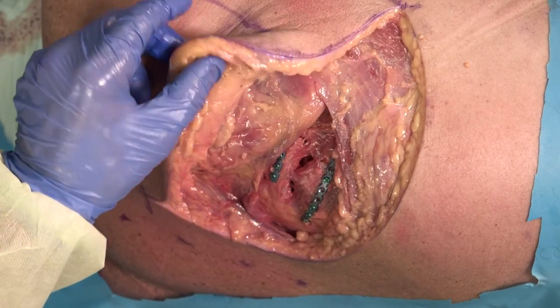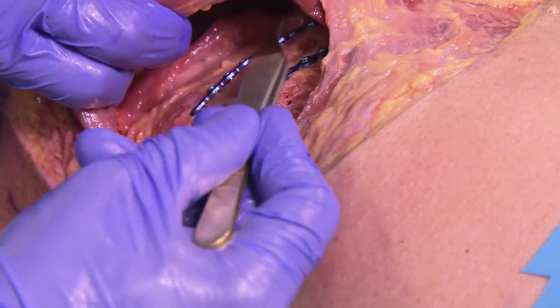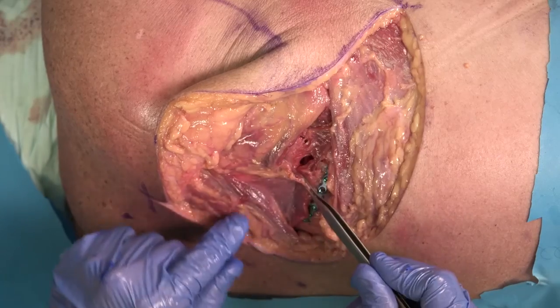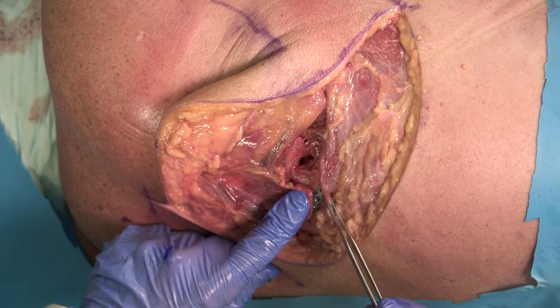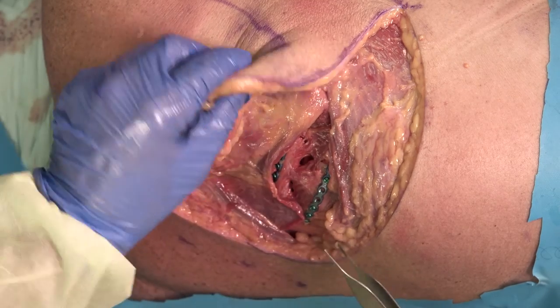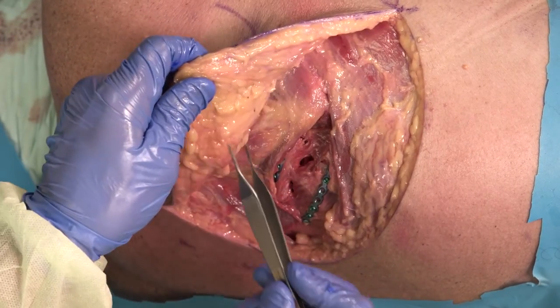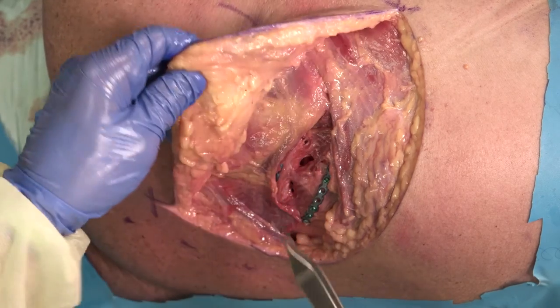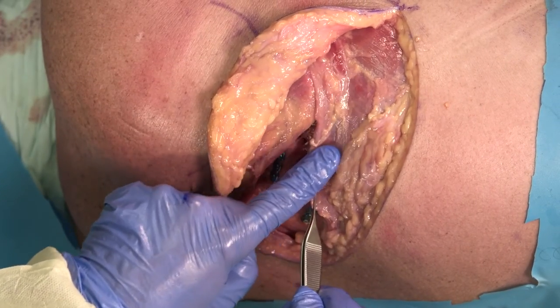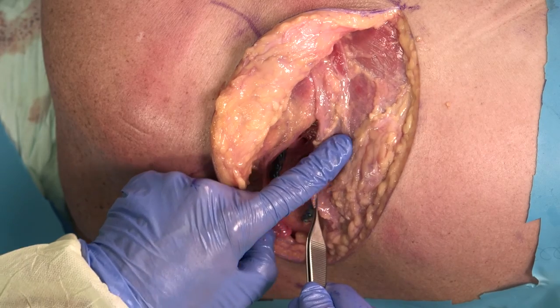Closure of the posterior lateral thoracotomy is done in stages. The stretching of the muscle tissue can be significant, especially if accessing a wide breadth of the area. The muscles are brought together and loosely re-approximated with reabsorbable suture, which helps hold them into position and minimizes dead space. If using any local anesthetic or similar pumps, these can be placed prior to final closure. The underlying fascia, which may be stripped off significantly, is tacked back down to the muscle to minimize post-operative seroma formation — a closed suction drain is typically not necessary. During closure, the palpability of the plates can be evaluated; with overlying musculature brought together and leaving the triangle of auscultation open, these plates are found to be minimally palpable.